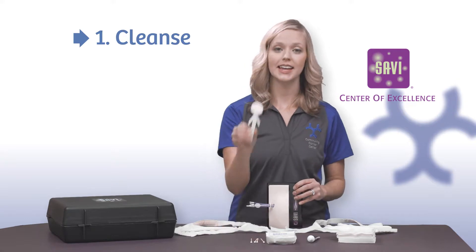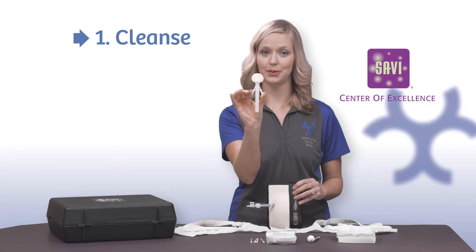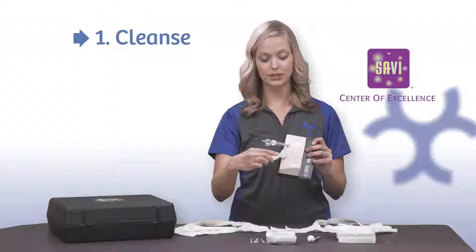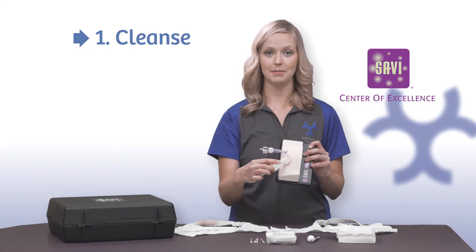Cleanse. Take the ChloraPrep and release the fluid by squeezing the two arms on the side of the tube. Apply a thin layer to the area surrounding the site, removing any debris that might be present.